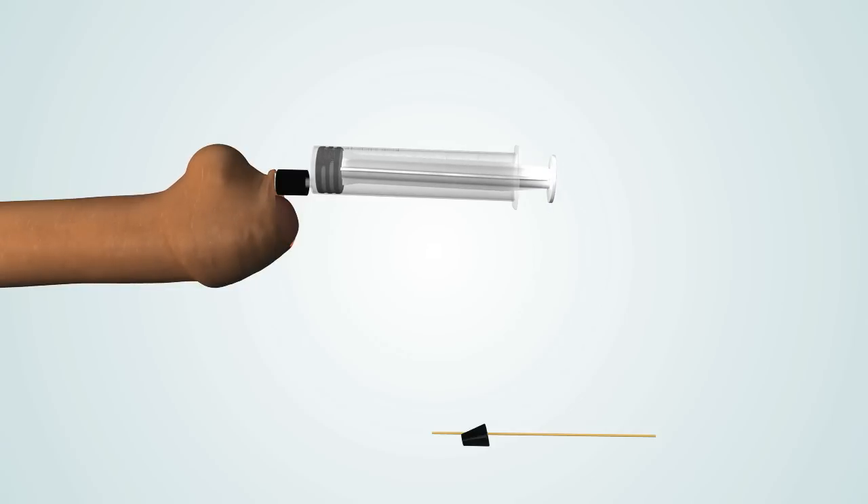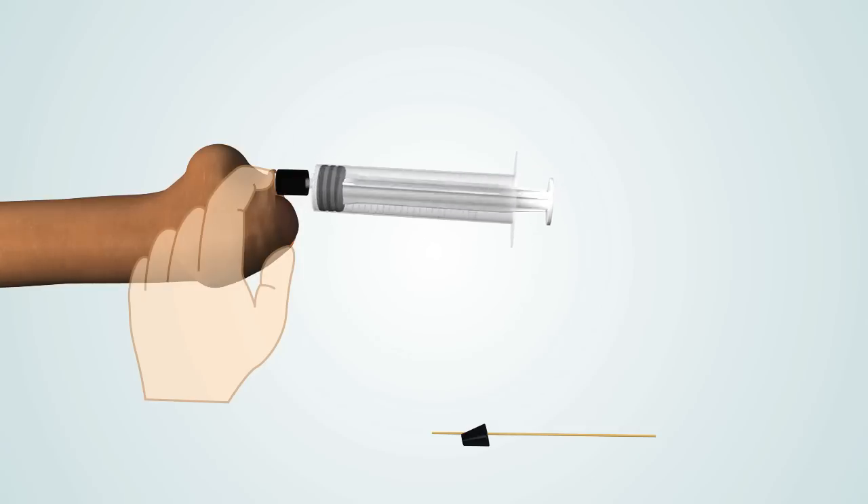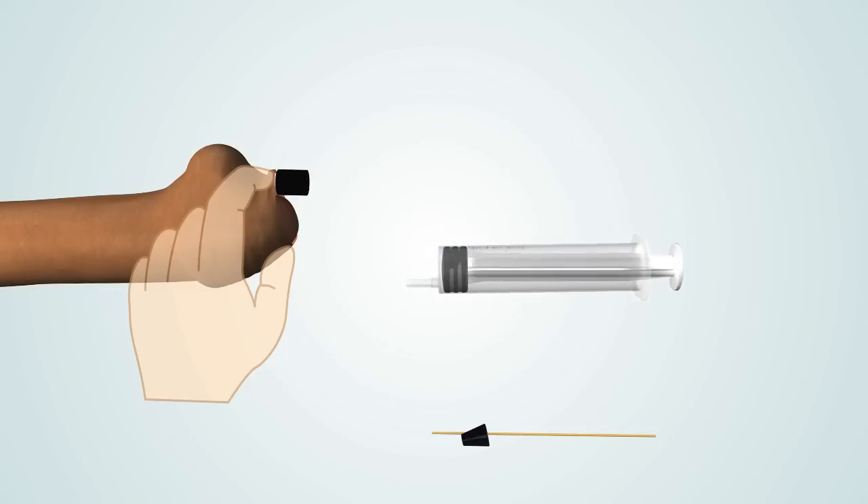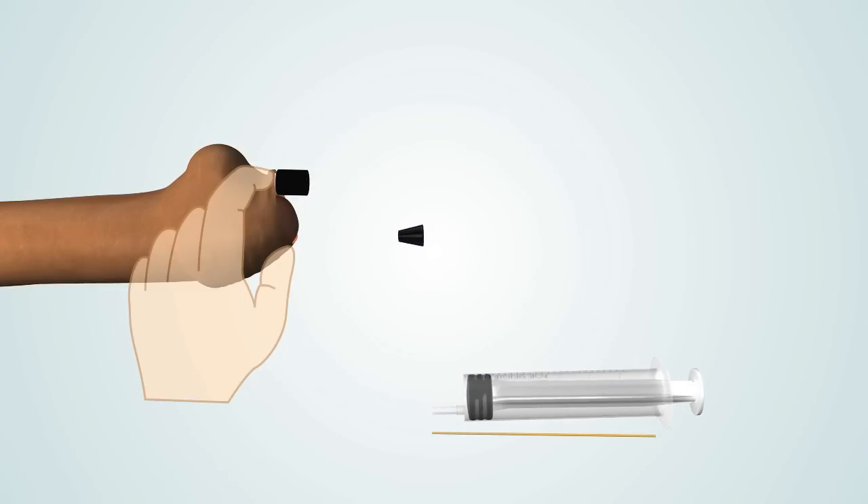Once inflated to the desired pressure, hold the balloon in place under the foreskin and twist the neck of the balloon three times by turning the NovoGlan device and air plunger. This will seal the air in the balloon to allow you to remove the air plunger. Gently remove the air plunger and insert the NovoGlan device plug into the hole in the back of the NovoGlan device.